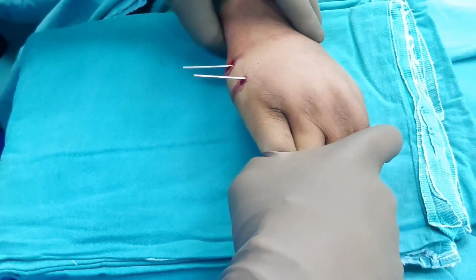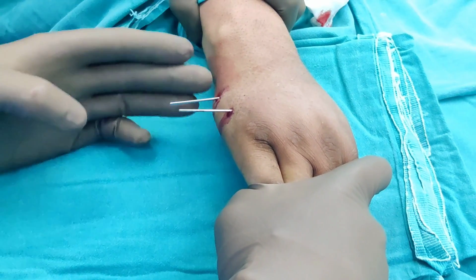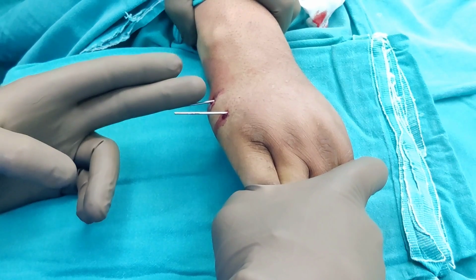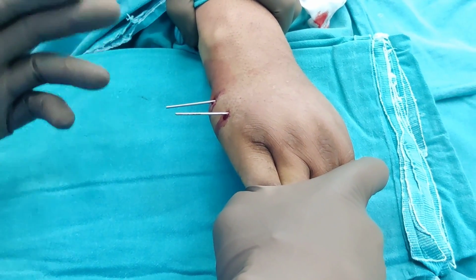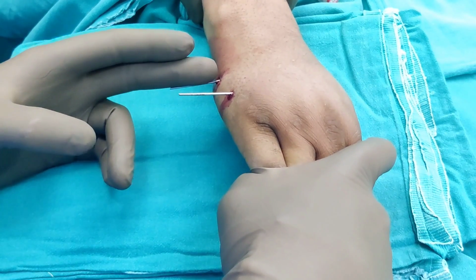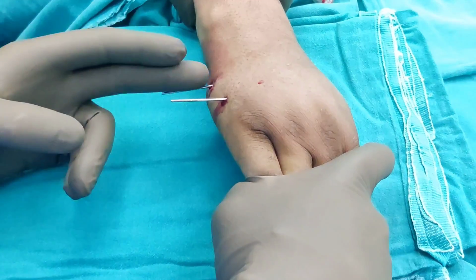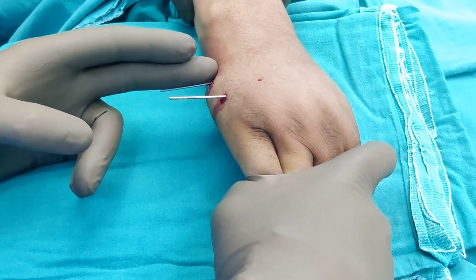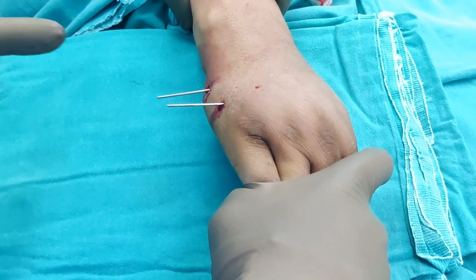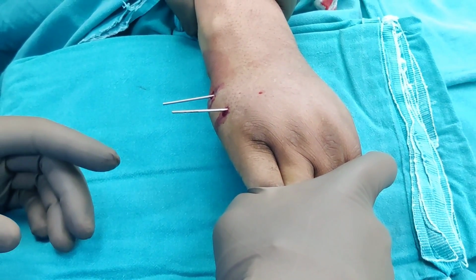So now we have passed our two wires, both of them are parallel to each other. One of them is proximal to the fracture site, the second one is distal to the fracture site. You just need to angle slightly dorsally, and you need to have a feel that it's in the bone. Then you will feel going into the bone, and then here you will feel it coming out, and then you will go in again. Because you are at a base, you are in the continuity, you might not get the same feeling of going into the bone or going out, but all the time you should have a bite that you are inside the bone. Now let me show you how it looks.